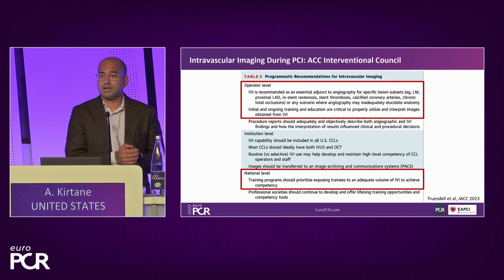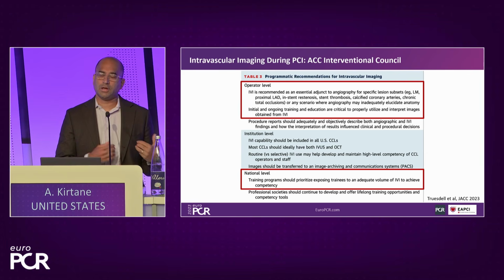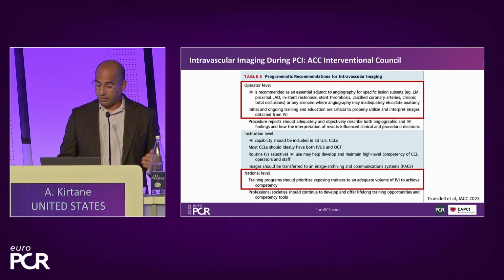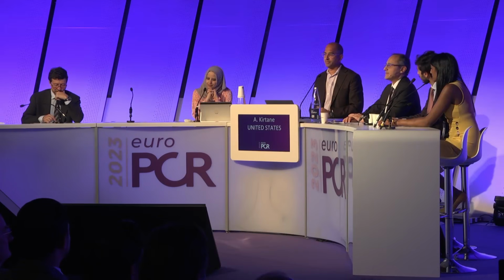So if you're only using it in complex disease, how do you know what you're looking at? You have to be able to do it in other cases so that you can identify those normal vessel segments, measure your distal diameter, measure the length, and do the case well. So with that, I'll conclude. I just want to thank you for listening. I'm certainly happy to see the case in this session, but I figured that would be a good way to start off this session. Thanks so much.